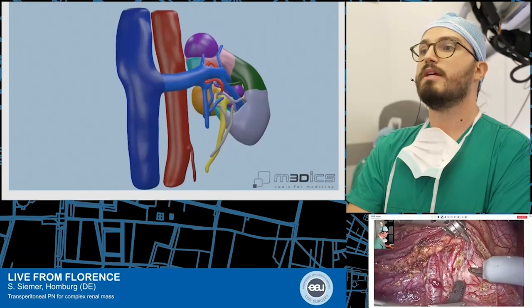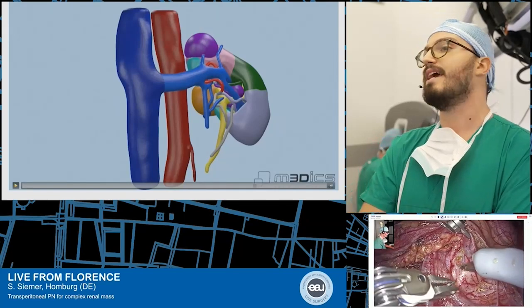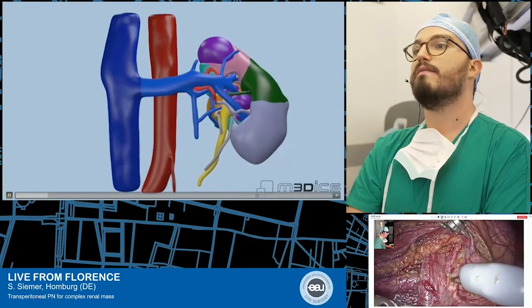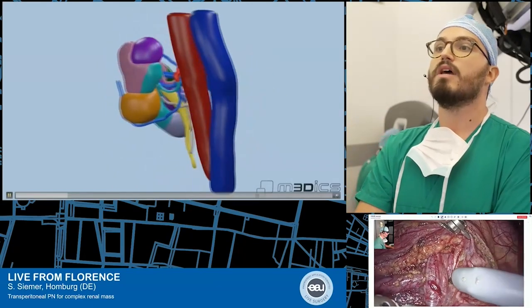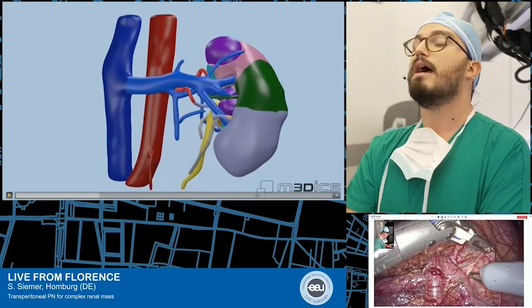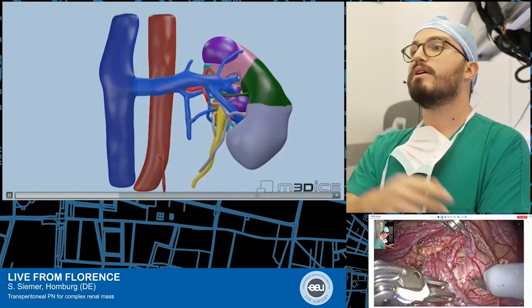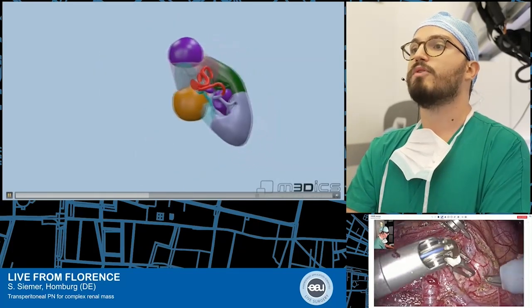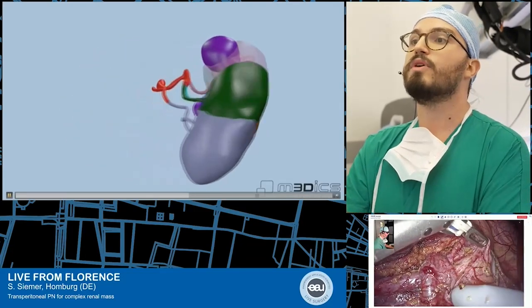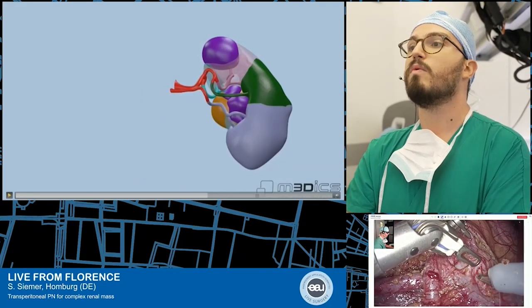This is a 3D reconstruction provided by medics that shows the complexity of the case and the anatomy. In blue you can see the vein, in red the arteries, in violet the cysts — there are some small cysts around the pelvis — and in yellow the renal excretory system. Two renal arteries are visible; the main artery is the superior one.